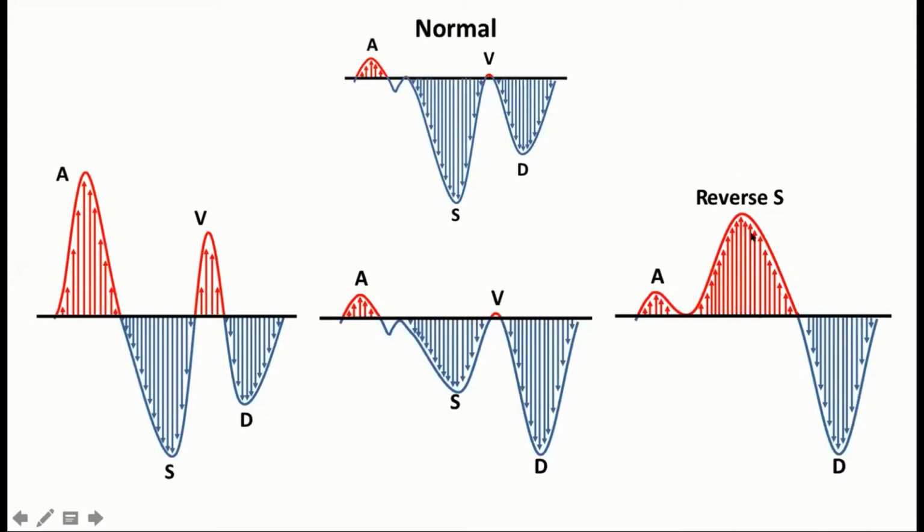And this is classic severe tricuspid regurgitation, in which a great proportion of the flow during ventricular systole is actually going back to the liver. So it creates this reverse S wave. And so, as you can notice, analyzing the flow pattern on the hepatic vein can actually give us a lot of information about the filling pattern of the right heart. However, it's important to notice that it does not give us a lot of information about its filling pressure. So only pattern, not pressure.